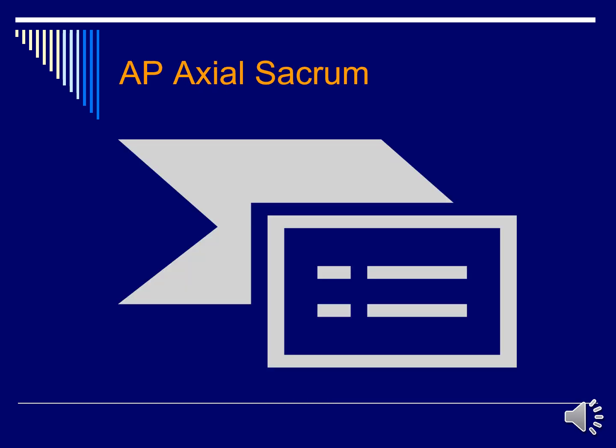Okay, we're going to go on to the AP axial sacrum. So for both the sacrum and the coccyx, you want to ask the patient to try to void or defecate because you don't want to have anything in their bladder or any fecal material superimposing those structures, although it is very difficult to get somebody to use the restroom on command.